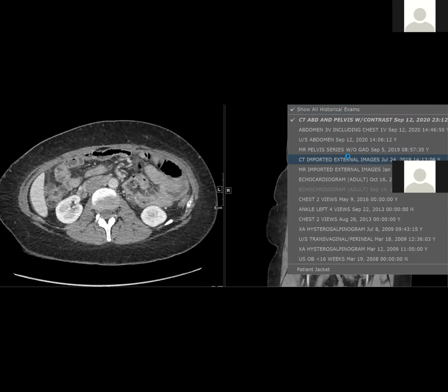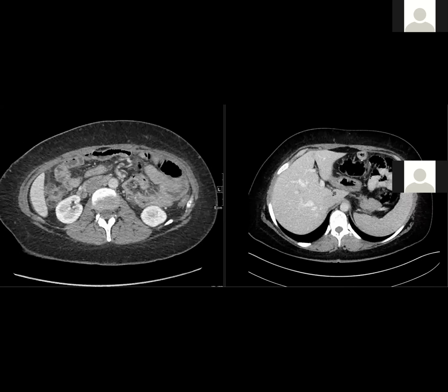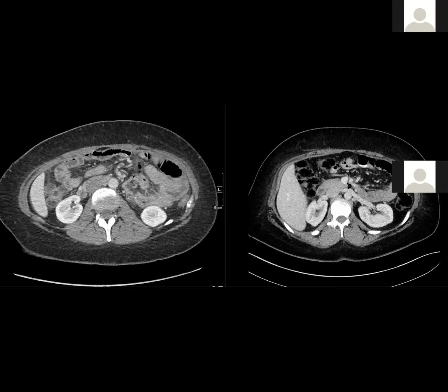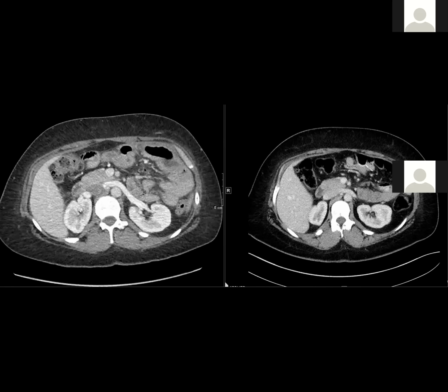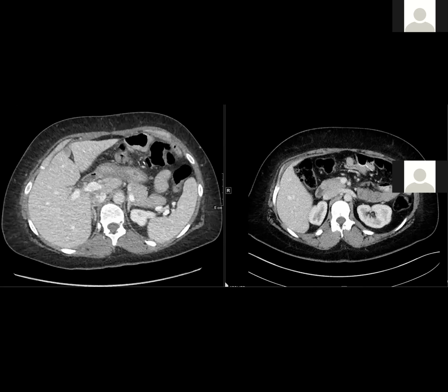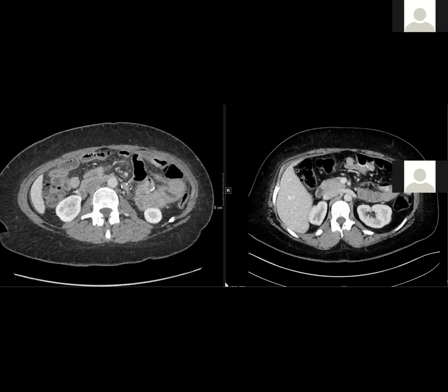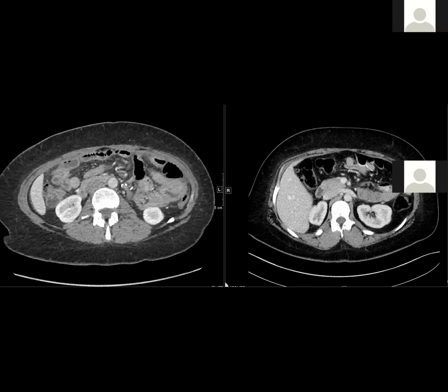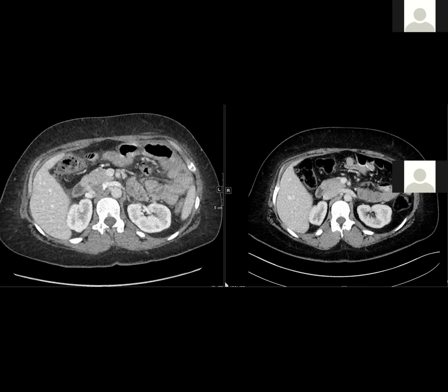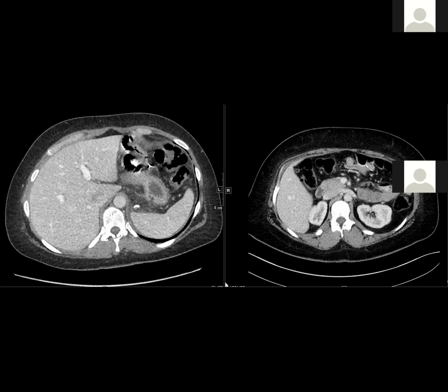And we had a prior CT in which, if you see, the relations of the SMA and SMV were maintained and there was no swelling. So even the jejunostomy was located anteriorly here previously, that had moved posteriorly. So right here. So we suggested, and they operated it, and it was an internal hernia through the Peterson's defect. That's very cool. That's pretty scary kinking of the SMV there.